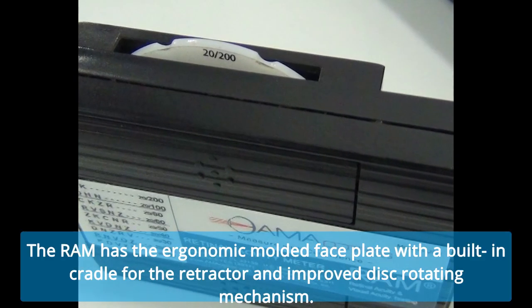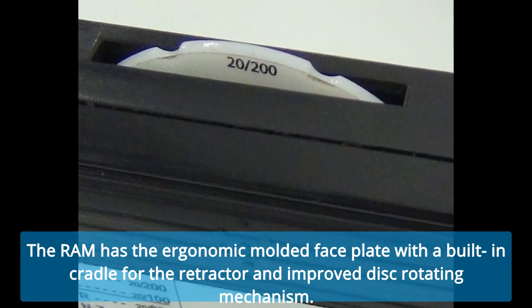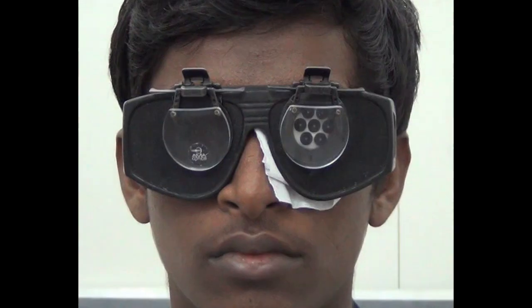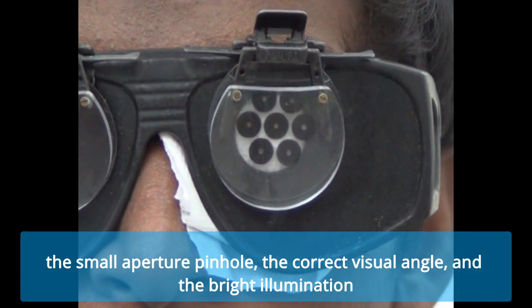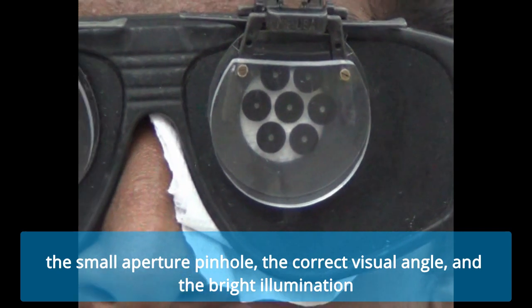The RAM has an ergonomic molded faceplate with a built-in cradle for the retractor and improved disc rotating mechanism. The RAM technology is a combination of three basic optical principles: the small aperture pinhole, the correct visual angle, and bright illumination.